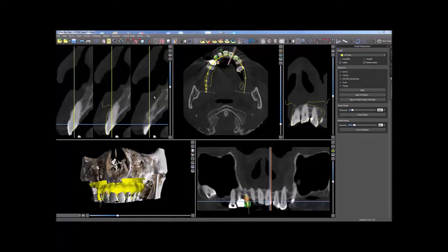STL models can be imported into the patient's CT scan and aligned in order to provide the base with which to design a surgical guide or printed model. When it is necessary to align an STL model to another model or scan appliance that has already been aligned to the CT scan, the Align to Model functionality can be used.